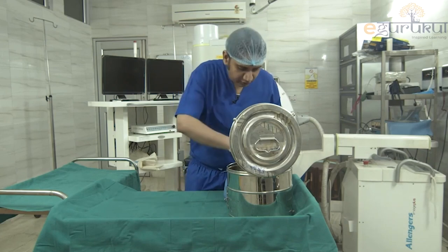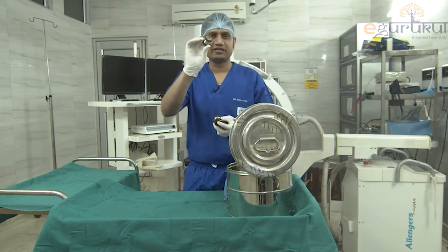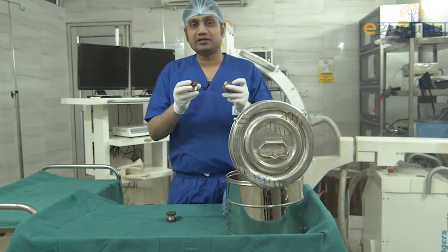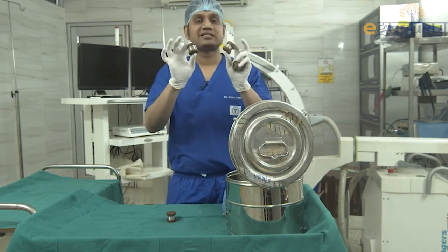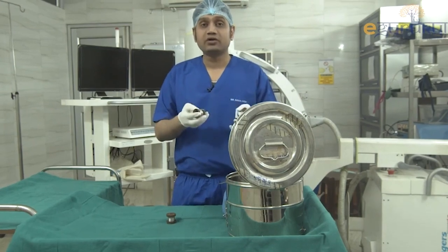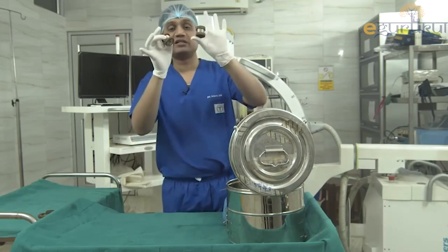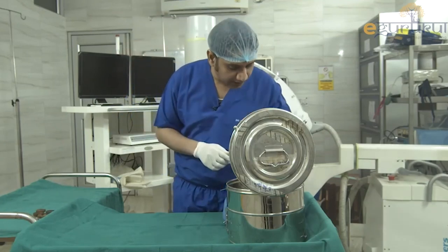The first items are four small wires — very thin stainless steel wires. These are used whenever you are doing tension band wiring, for example at the medial malleolus, patella, and olecranon. They are used for tensioning around a particular bone. The four wires differ in width and thickness, and we choose accordingly based on the site, bone, and age of the patient.